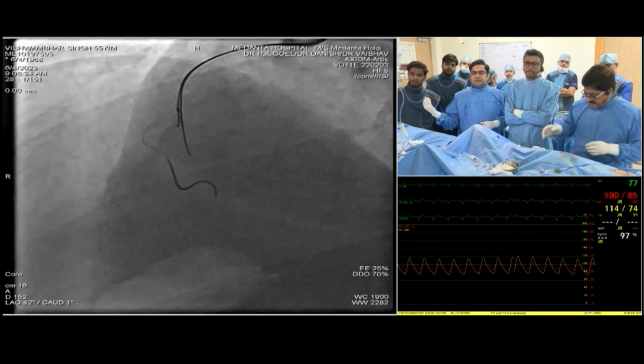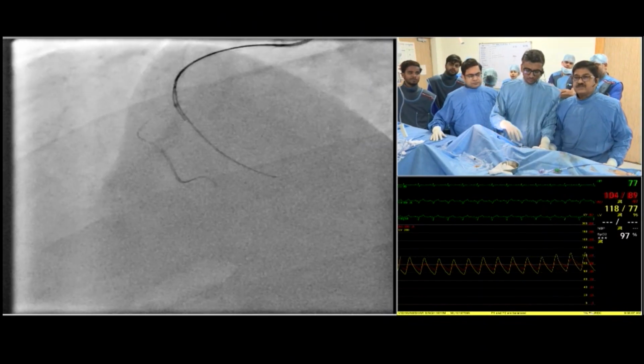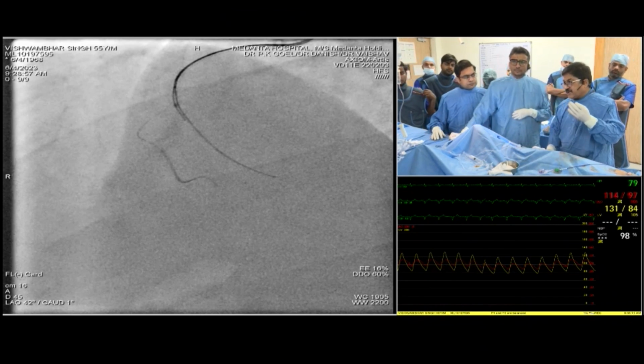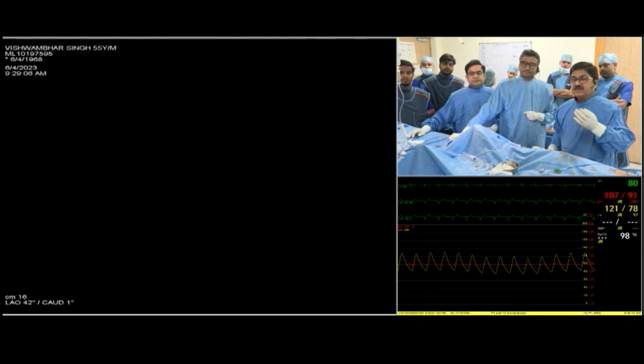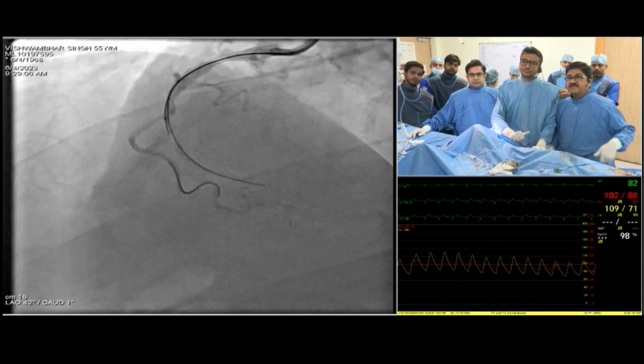This is the last where I am. Can I see it where I am? Yeah, so that is where I then pushed it forward. I used the 3D wiring concept that I was talking about yesterday. Angiogram please, because contralateral doesn't fill it very well.